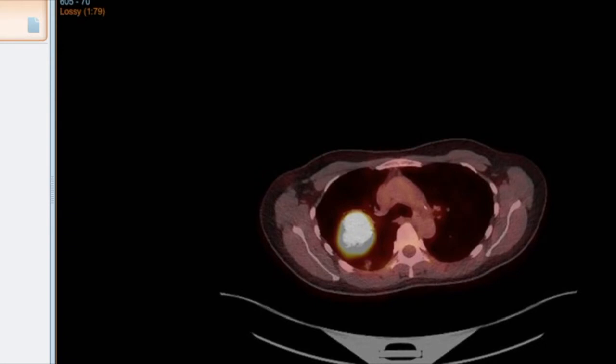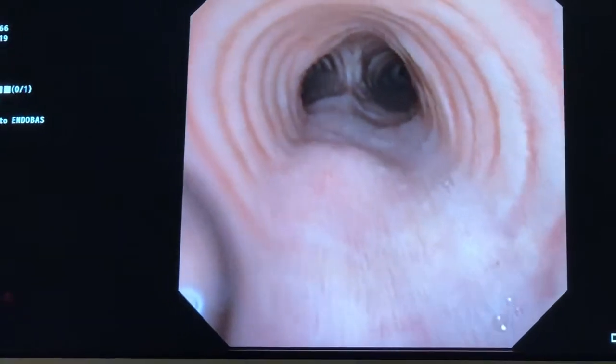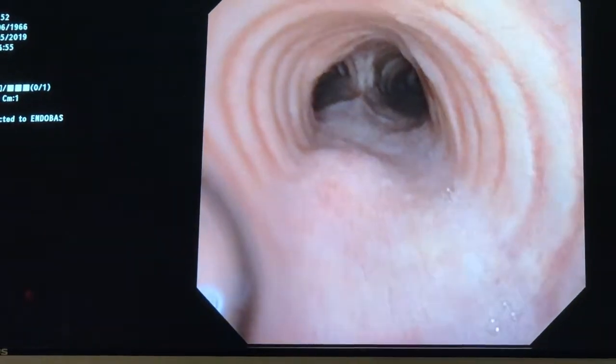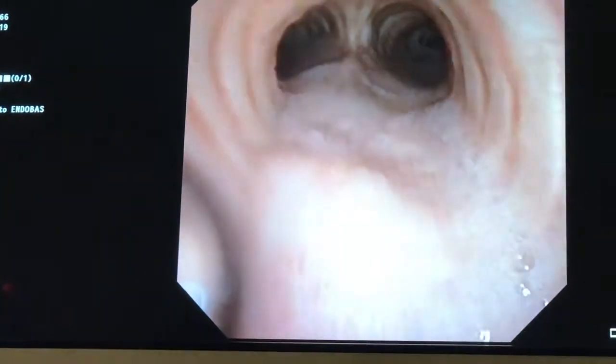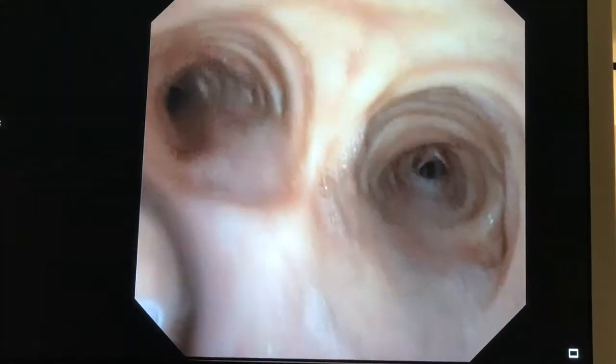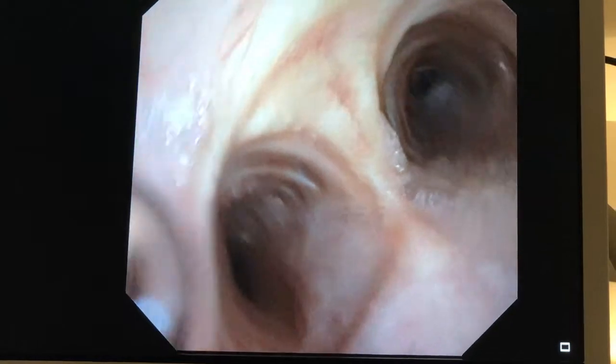So it'll be interesting to correlate these findings with the bronchoscopic images when that's performed for staging and also for diagnosis. So here we are in the trachea performing the bronchoscopy. There's the main carina.